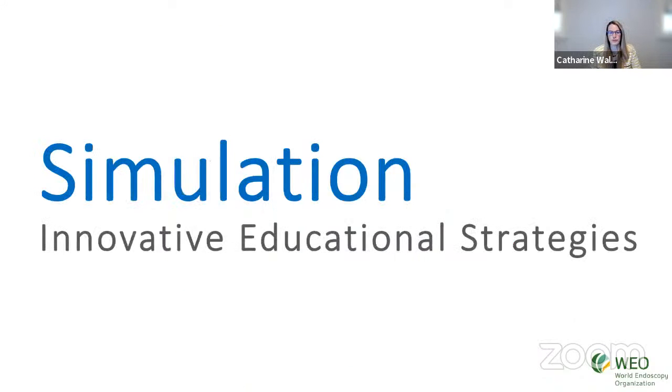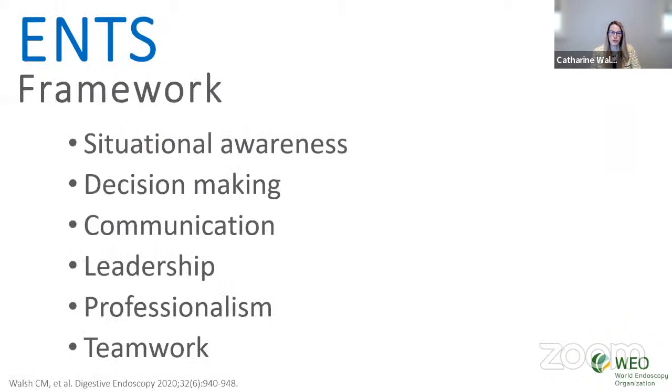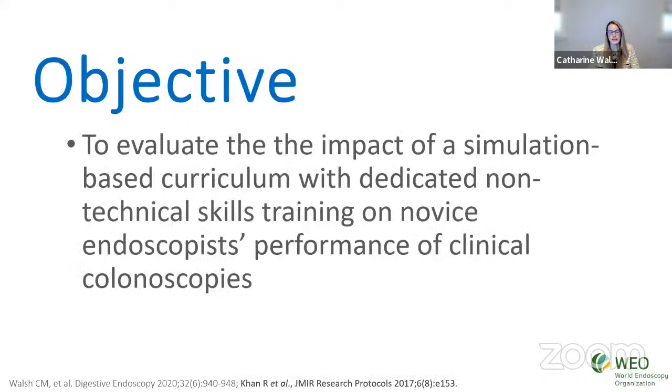Finally, I'm going to touch on a few innovative strategies that are being applied to simulation-based training in endoscopy. As I mentioned, non-technical skills are a really important part of performing endoscopy, and these refer to things such as situational awareness or decision-making, communication, and leadership. We wanted to look at whether focusing simulation training on non-technical skills affected people's clinical performance when they went to perform the skills in the clinical setting. So we carried out a study looking at the impact of a simulation-based curriculum with dedicated non-technical skills training, and whether that improved people's performance in the clinical setting.